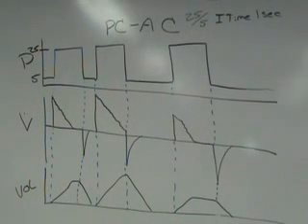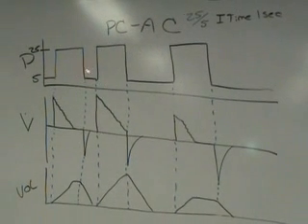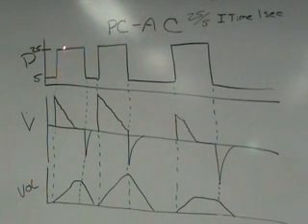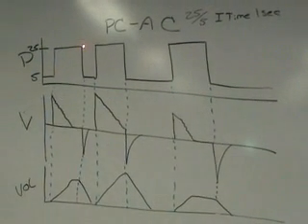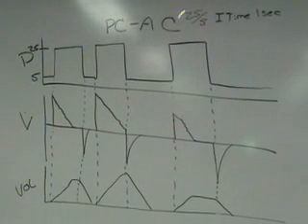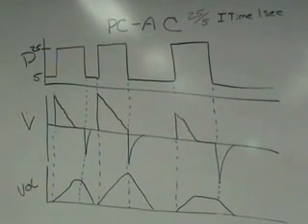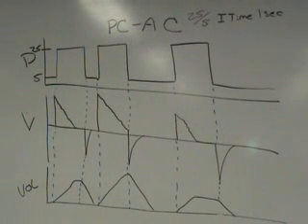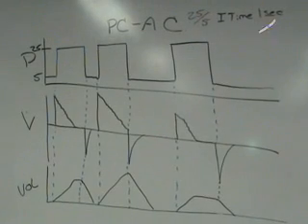You know, if I were to classify it, I would say pressure control assist control is either patient or time triggered, pressure limited, time cycled ventilation. Okay? In layman's terms, I set a pressure level, I set a rate. If the patient doesn't breathe over the set rate, they will get that pressure level at that set rate. If the patient breathes over the set rate, they get that pressure level at the set I time.